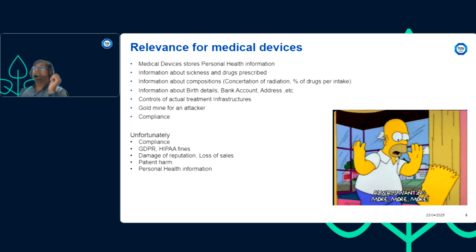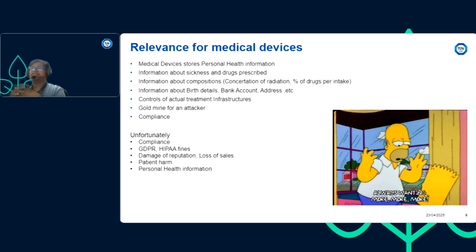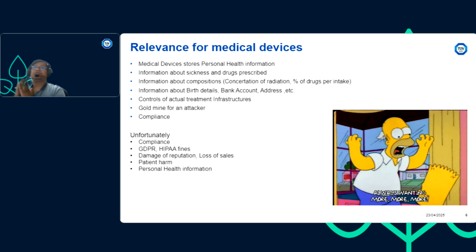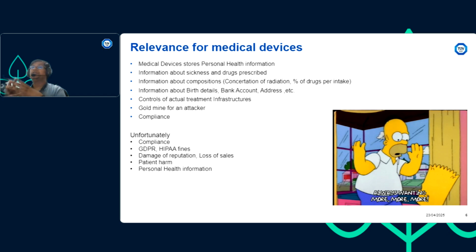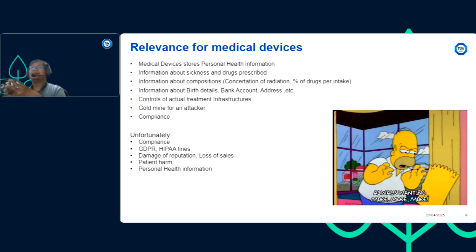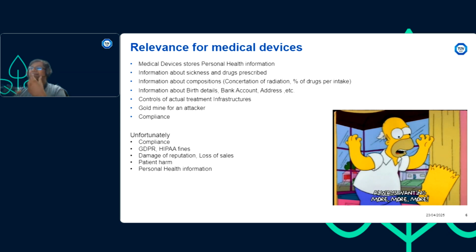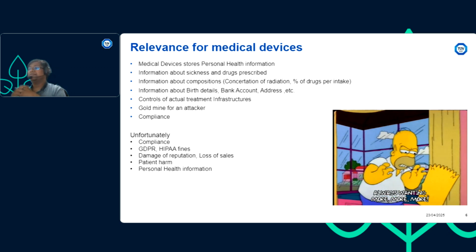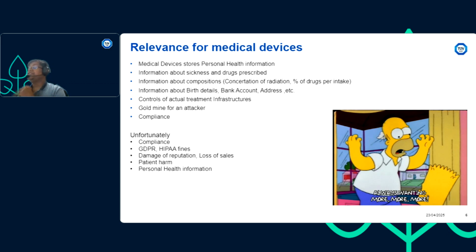Now, here is, unfortunately, what we currently see. Not everyone, but the trend shows that people usually do security testing for compliance to start with, and then they are worried about GDPR and HIPAA fines, damage of reputation, loss of sales, and patient harm, and obviously the personal health information.